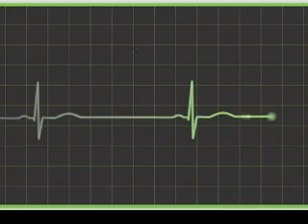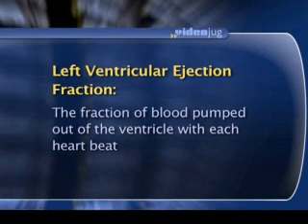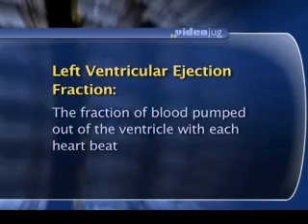That's important because we can get information about cardiac function in such indices, for example, as left ventricular ejection fraction, which is an important parameter for us to know. So gating is used in conjunction with imaging to give us functional data on the heart.